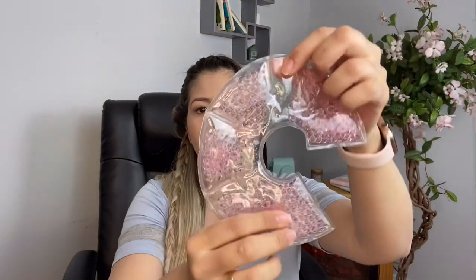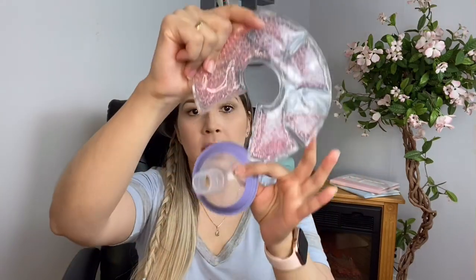Heating gel pads also help — put them around your breasts, around the flange, so the flange and breast get warm. It's the same principle as taking a warm shower when you're engorged, to relax the ducts. I put these pads in the microwave for 18 to 19 seconds, making sure they don't touch each other so they don't melt.